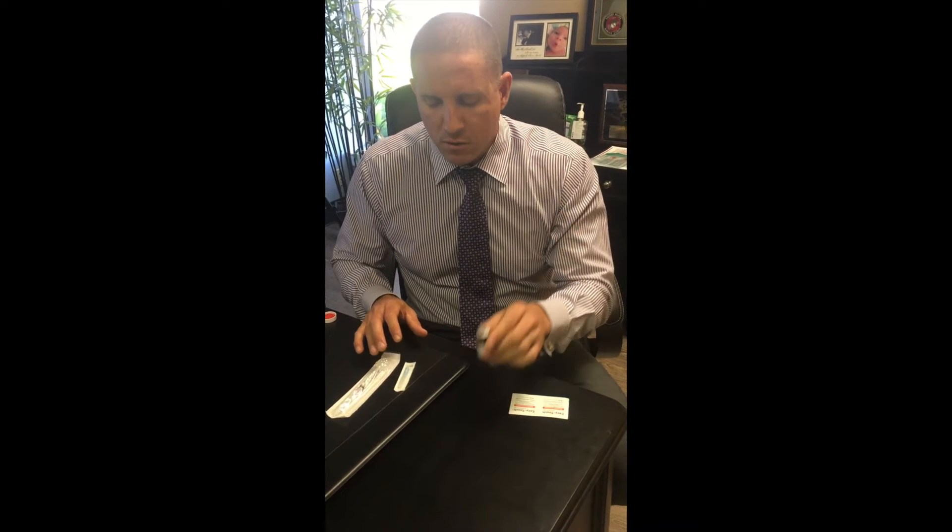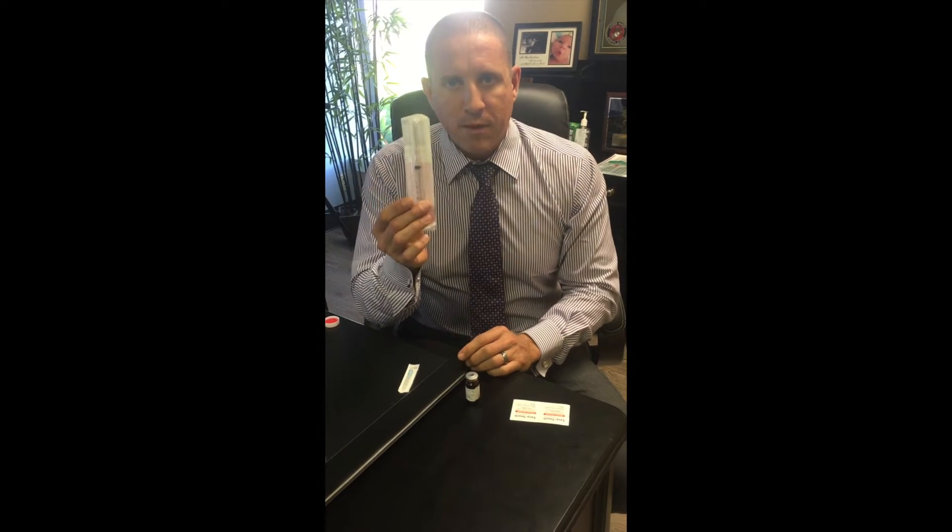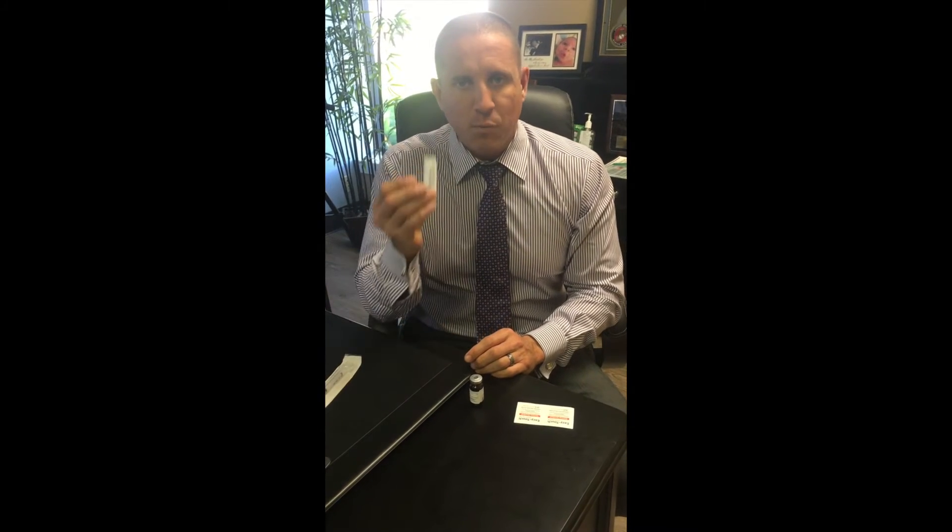When you get your testosterone, you're going to get a 10ml vial of testosterone cypionate and propionate. You're going to get one 3ml syringe and a bunch of 25 gauge 1 inch needles.